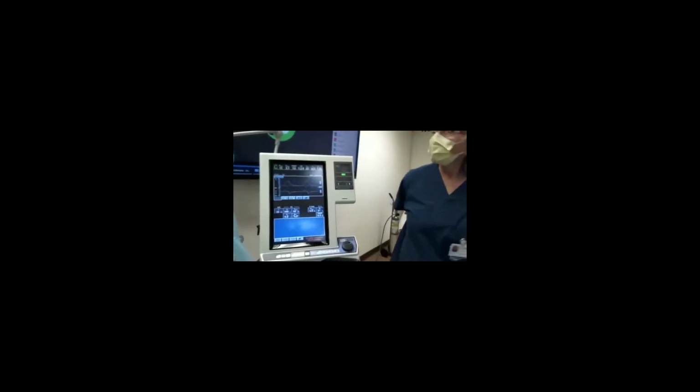Plus, you can also allow for permissive hypercapnia. We'll talk about that later as well. So then you have your peak that you monitor. If you or I were going to bed right now with our healthy lungs, our peak airway pressure would be 10 to 15. That gives you an idea of the stiffness that can happen with the ARDS patient.